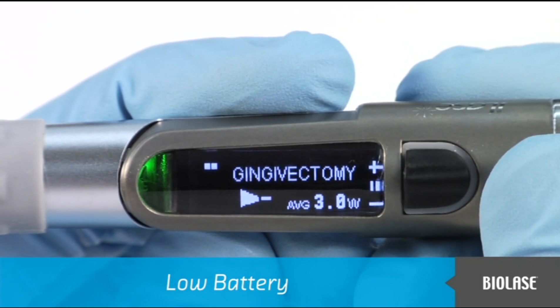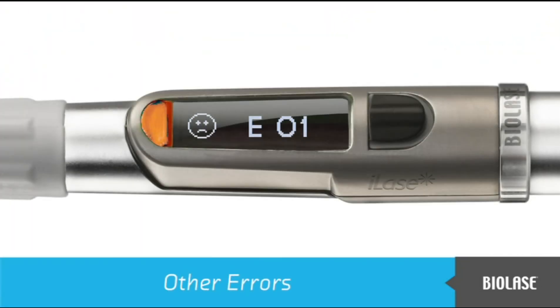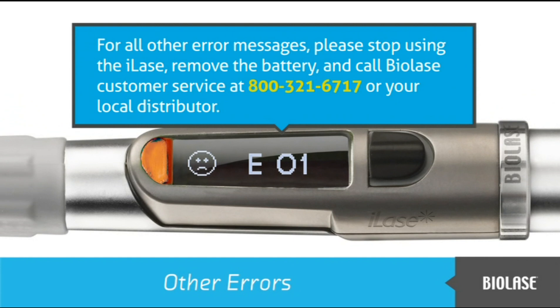The battery that is almost empty should also be recharged in the charging station. For all other error messages, please stop using the iLaze, remove the battery, and call BioLaze customer service or your local distributor.